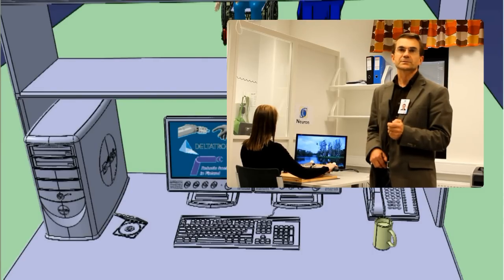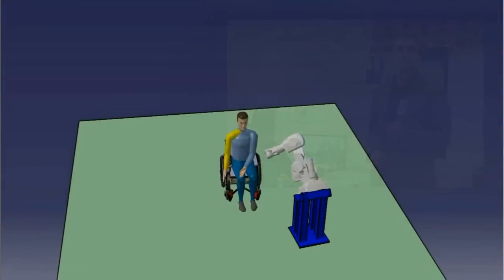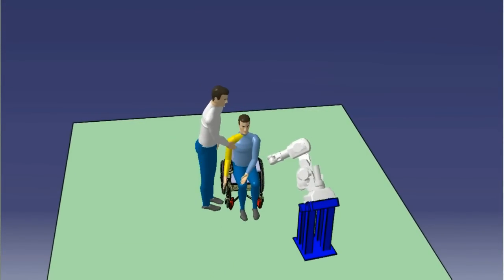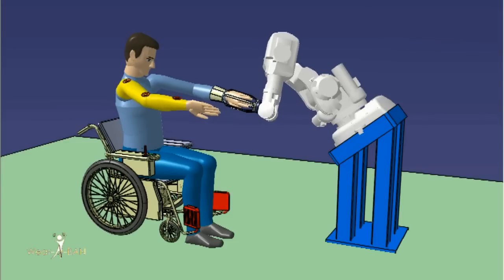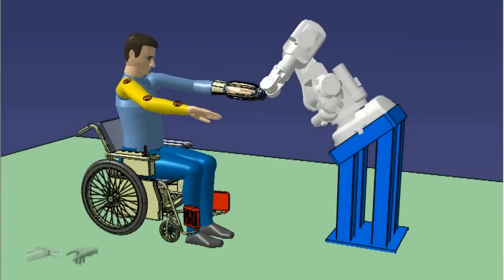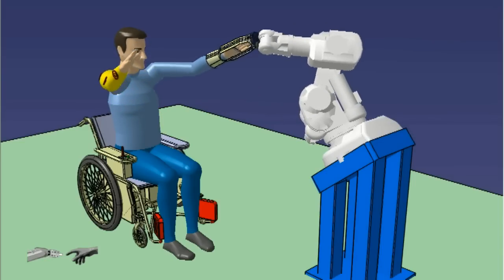A major challenge is to provide sufficient amount of resources to ensure good outcome after stroke. Therefore, it is very important to develop new strategies to improve the effectiveness of rehabilitation. Task-specific robot-aided training is a promising new approach to enhance neuroplasticity, which is the basis of good recovery.